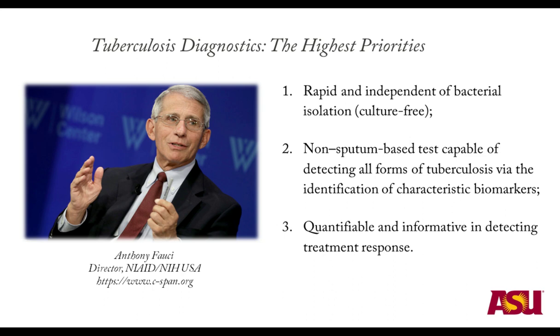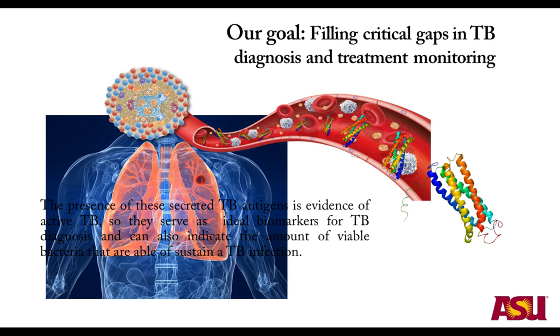Okay, based on such needs, we generated such a hypothesis. At first, it is very straightforward: we try to capture the antigens secreted from tuberculosis in the blood. So we spent almost a year to develop an ultra-sensitive ELISA or immunoassay method to capture those antigens. But even after we captured them, we realized this is so difficult.